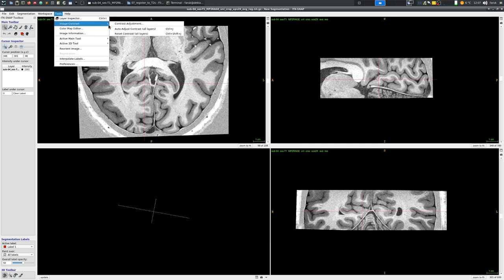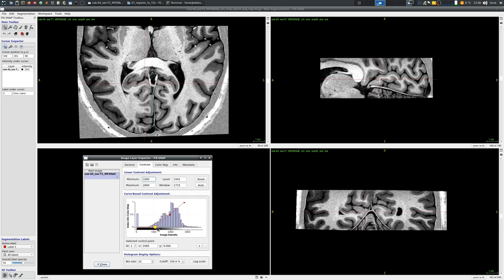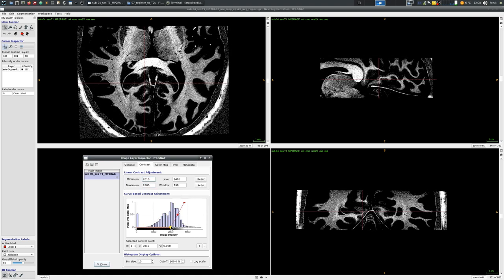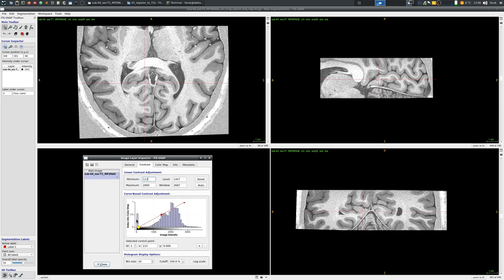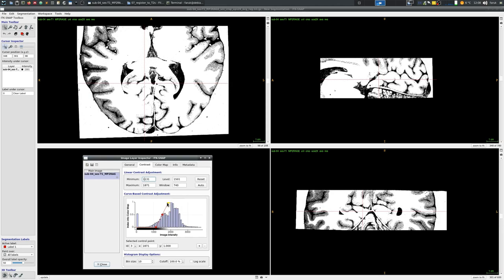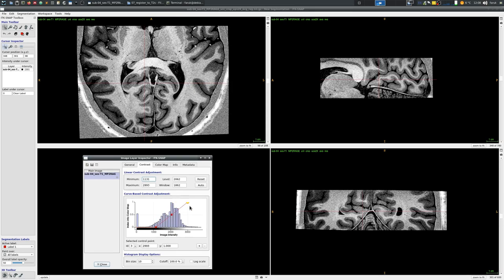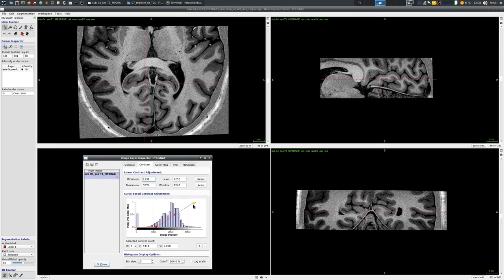Right now I am going to show you a very important part of ITK snap: the image contrast menu. In this menu you can manipulate your color map. For instance here I have a grayscale color map that maps the value written in each voxel into a gray level and here you can see that I am adjusting the minimum point and the maximum point to make my image appear darker or brighter.